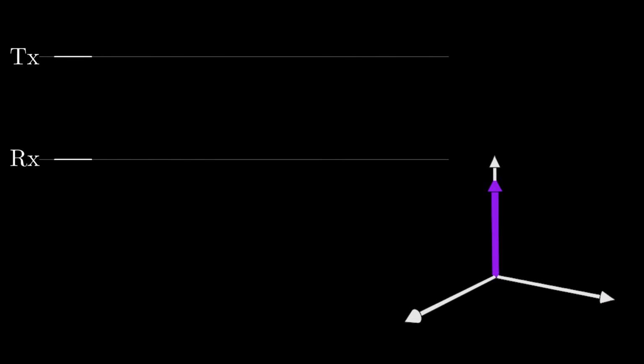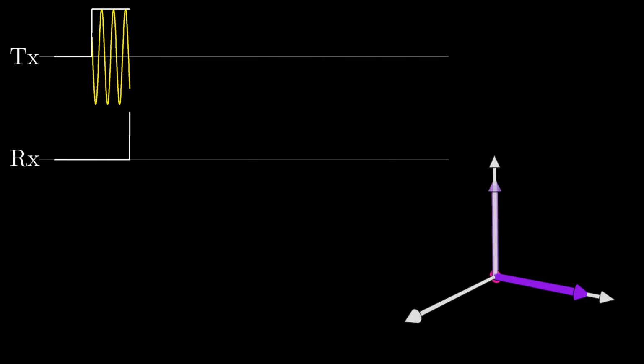Okay, so the simplest NMR experiment we can devise is to place a sample of spins in a magnetic field B0 and deliver a separate magnetic field B1 perpendicular to B0 about which the magnetization will precess. In a reference frame which rotates at the Larmor frequency of our magnetization M in B0, the B1 pulse is stationary.